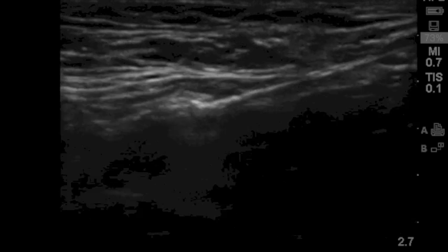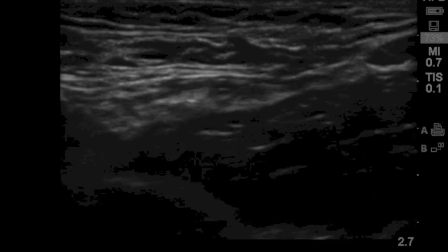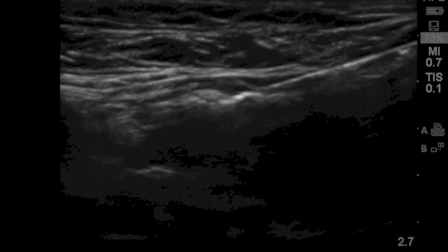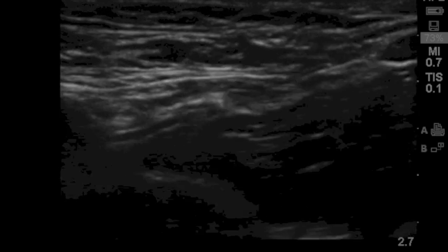This is a live block example of a femoral nerve block on a left leg. The needle is coming lateral to medial, right to left across the screen. The femoral artery is just on the screen. A nerve stimulator is being used, so the needle seems to jump in and out of plane. Once I've confirmed that I have my twitch, I tend to turn my nerve stimulator off. I'm interested in positioning my needle just under the nerve and beginning my injection there, looking for good circumferential spread.